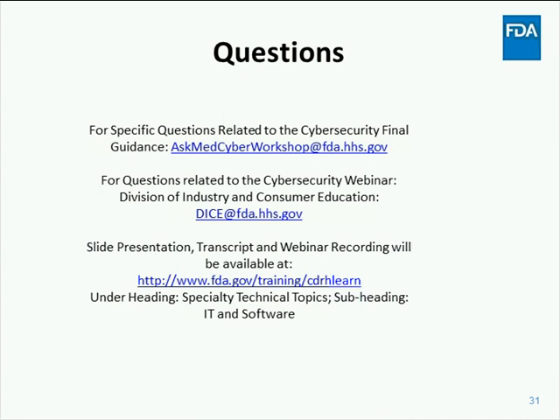The first question that you asked, I hesitate to call it a requirement. We've emphasized CVSS as a tool in order for you to assess risk. What we've tried to delineate in the guidance is that the base score and temporal score have parameters surrounding the vulnerability and the timeline of the vulnerability, which will help you to assess the risk. So from a requirement standpoint, I think it's a bit harsh, but we do recommend that you assess those parameters. The environmental score, the result of the modified base score, is what your defenses are. So you have the overall and aggregate risk and then assessment of the controls surrounding that device or device accessories. So as a requirement, I don't think that term fits, but in terms of assessing the entirety of your risk, we recommend using CVSS in its entirety.